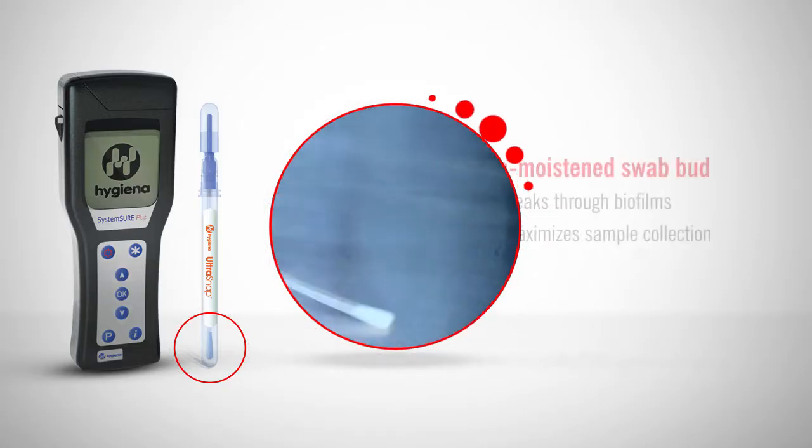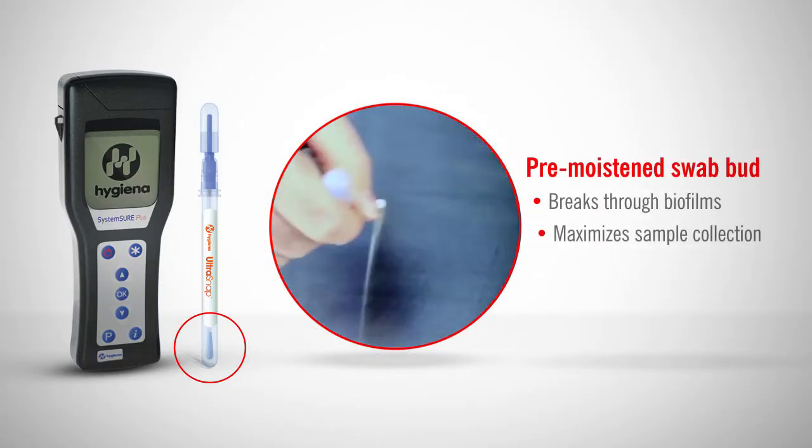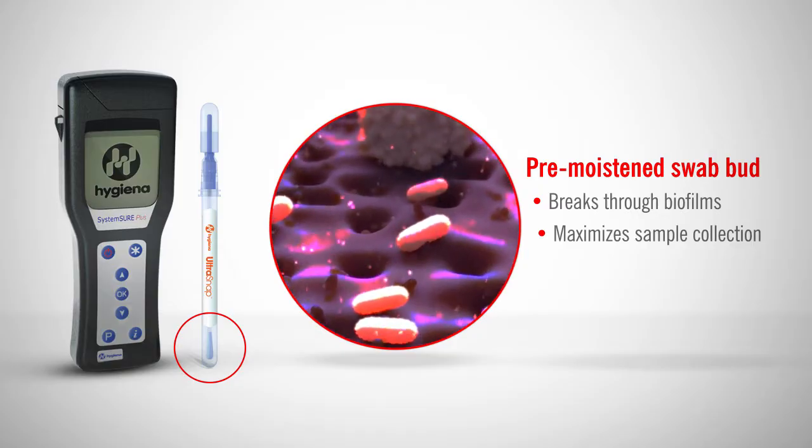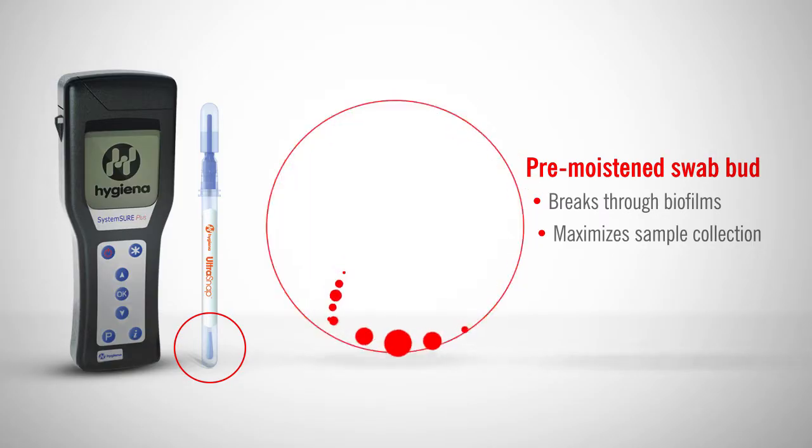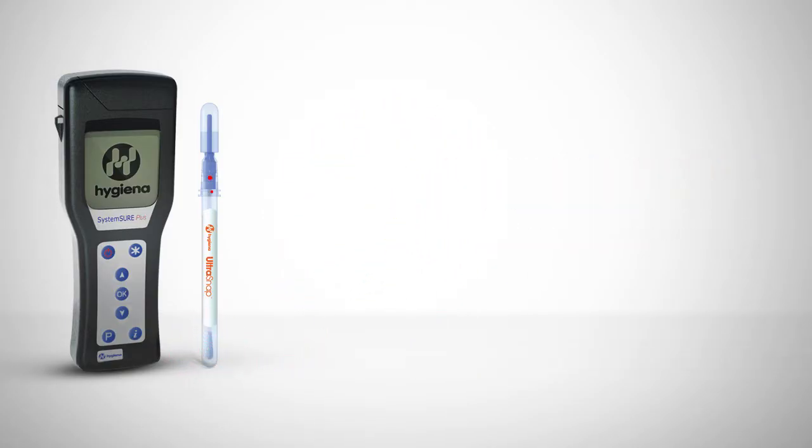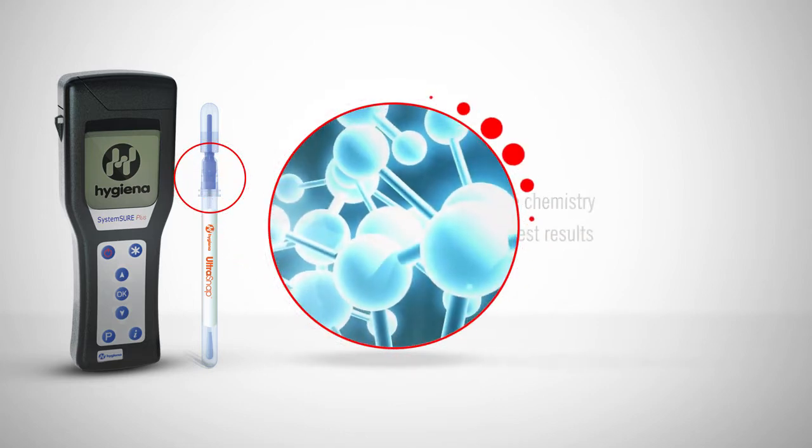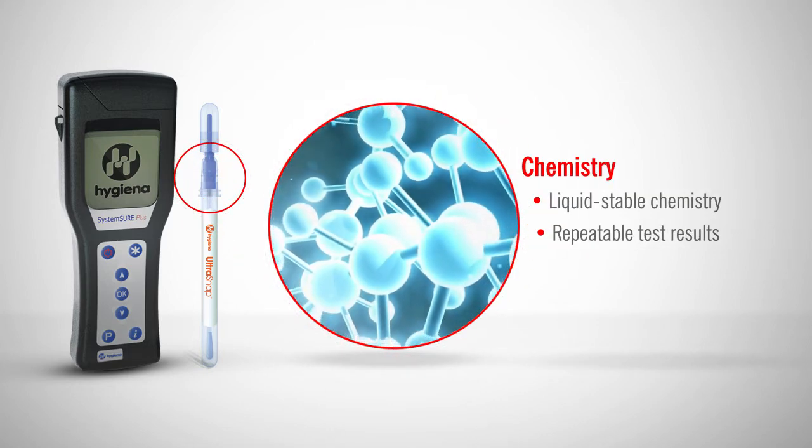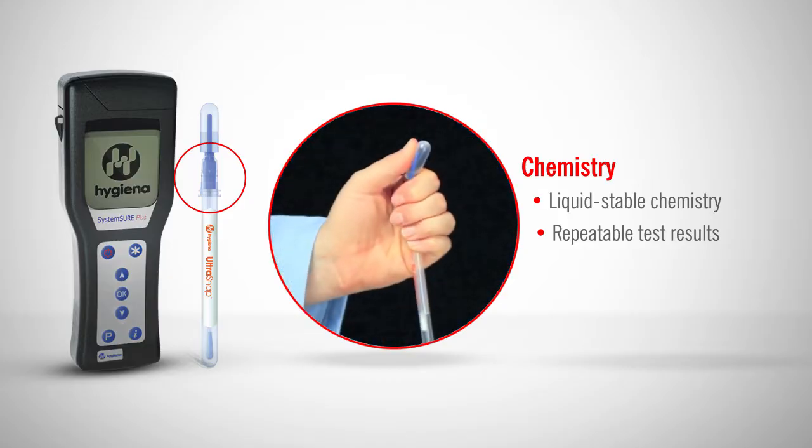Here are some important features about the system. The pre-moistened swab bud breaks through biofilms to maximize sample collection so you get the most accurate test results possible. And the liquid-stable chemistry with the patented SNAP Valve technology ensures users achieve repeatable results from test to test and user to user.